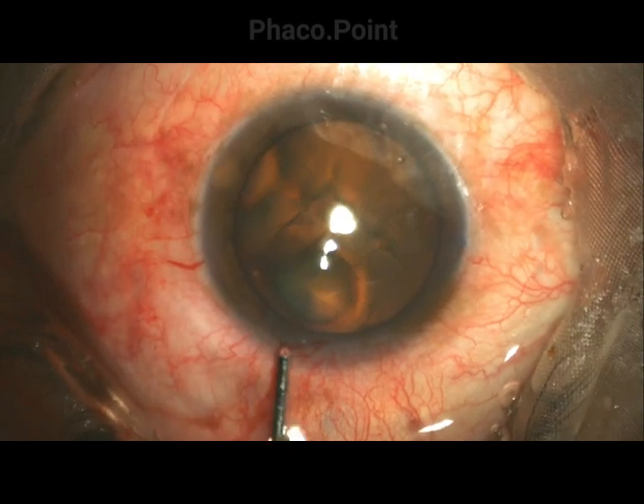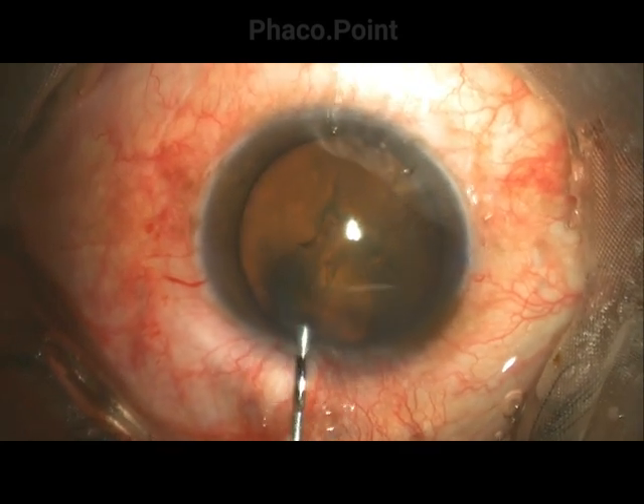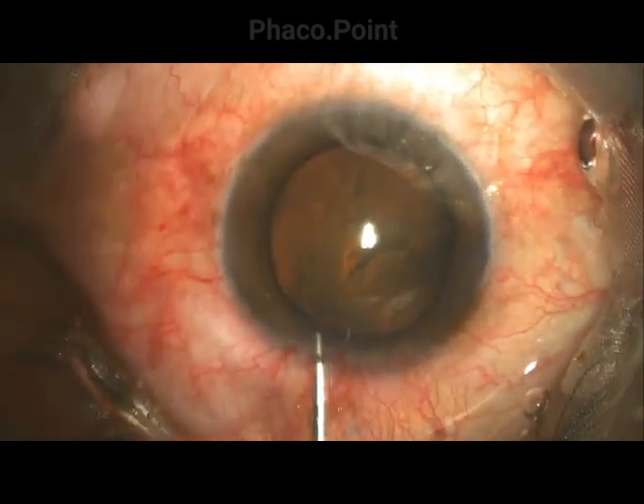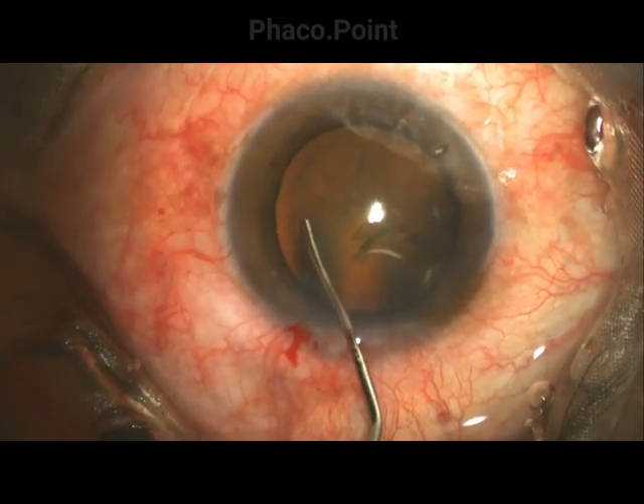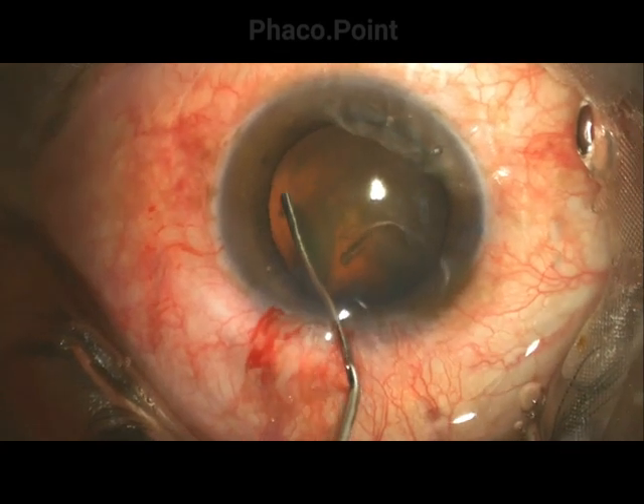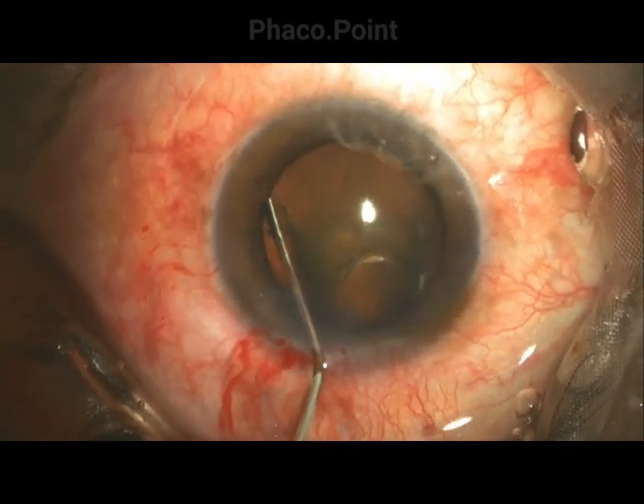Here's another case. The cannula, once primed, is introduced into the anterior chamber. The posterior corneal lip is depressed to remove some viscoelastic, and here the hydro cannula makes its way under direct visualization very slowly and carefully into the subcapsular space.